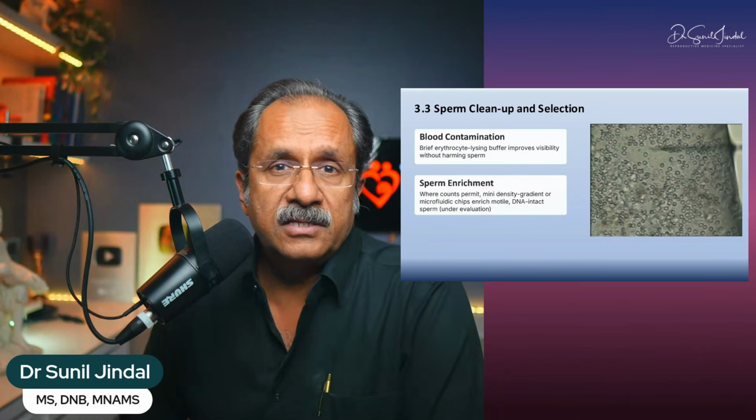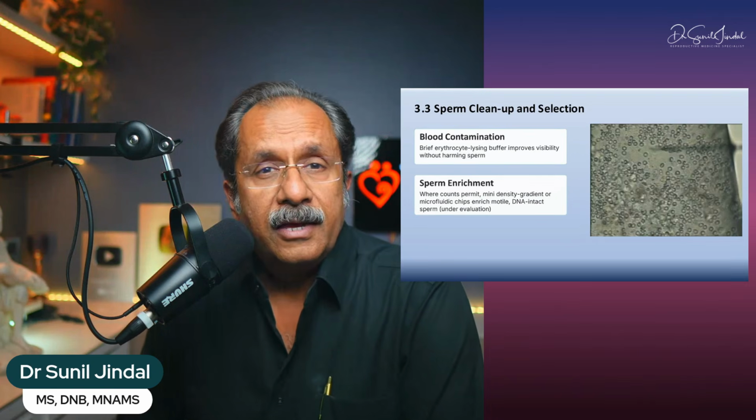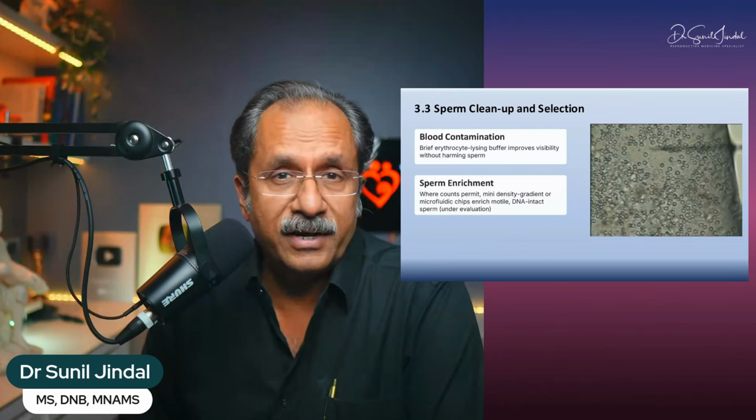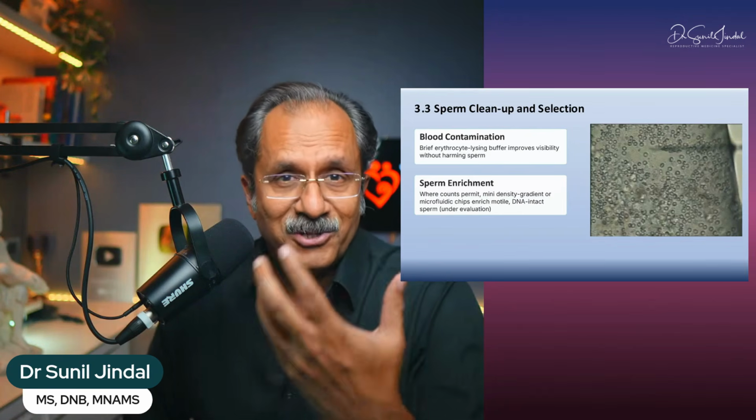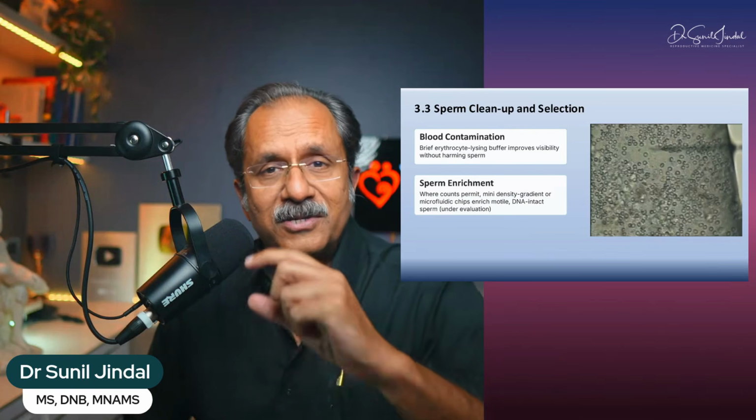And in this ICSI, there is one thing very clearly: if there is blood contamination, it's fine because that helps us in finding a sperm. I'll show you how for us. A lot of people use an erythrocyte buffer, but this is what we do. I'll just show you now.